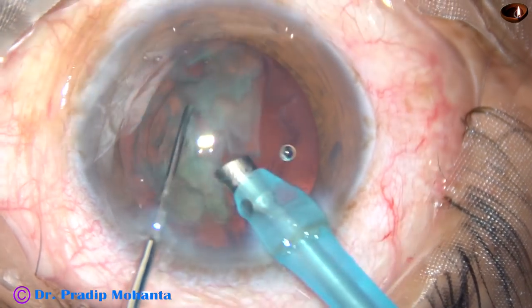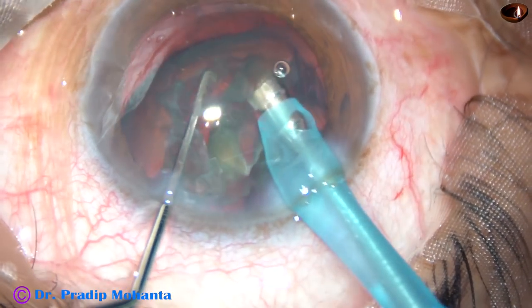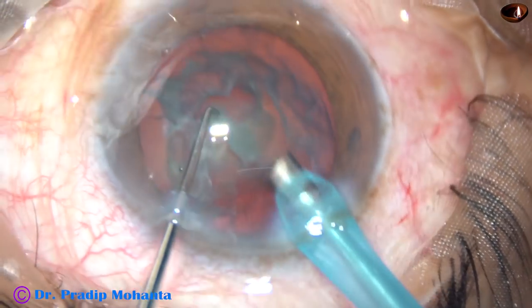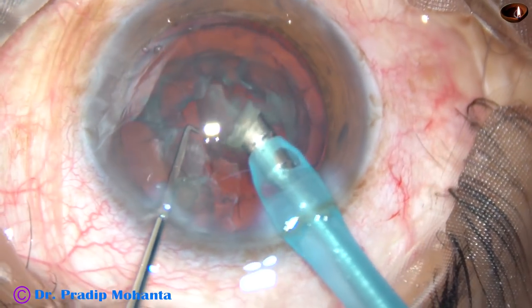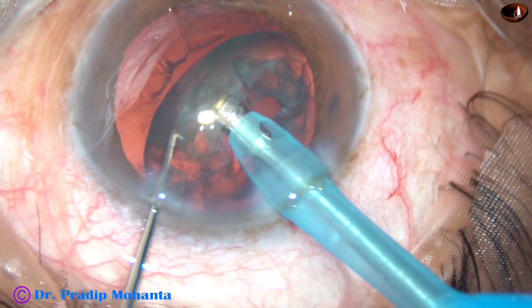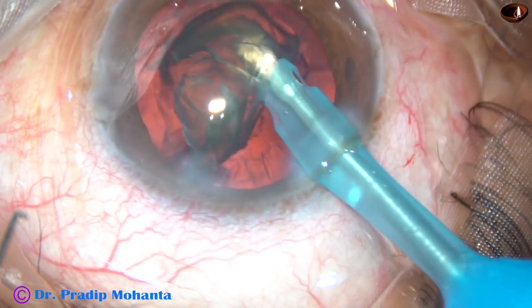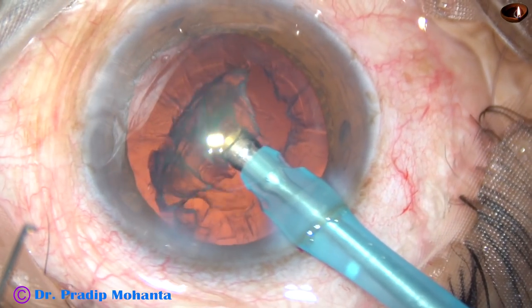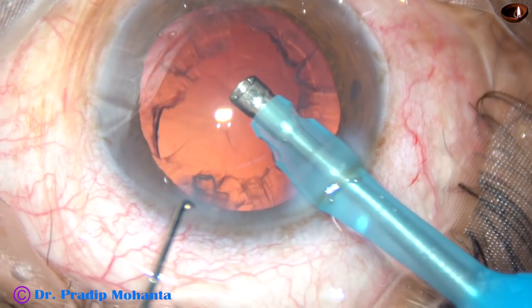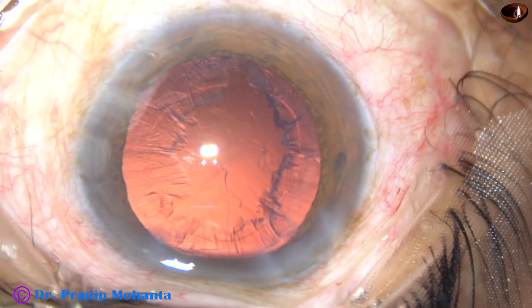And now this is the epinucleus. During this time, I have removed the instrument from the side port so that leakage from the side port stops, the anterior chamber becomes more stable, and followability of the pieces increases. The epinucleus is managed.